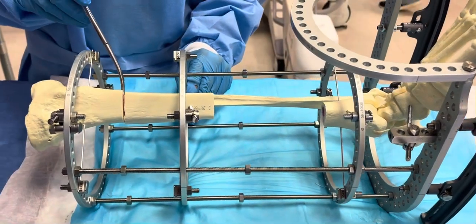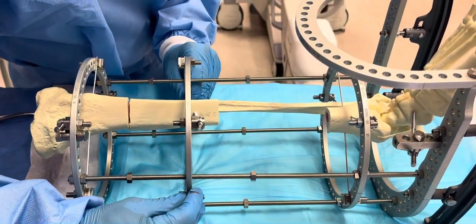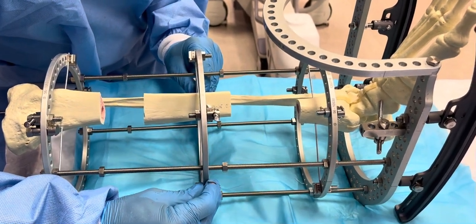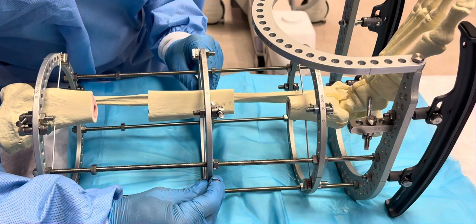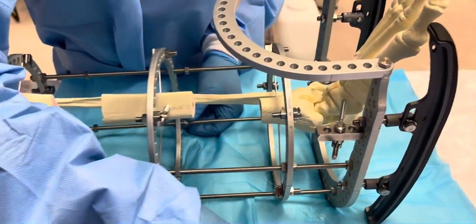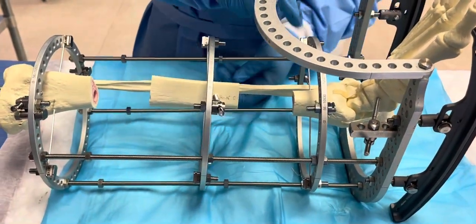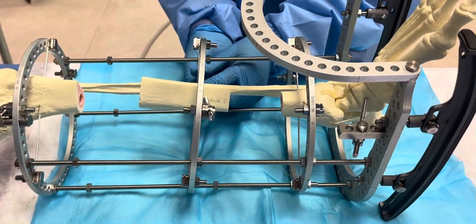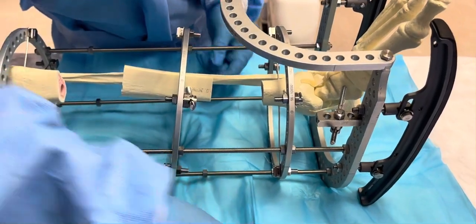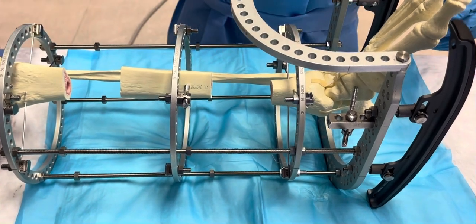An osteotomy is performed proximally at the metaphyseal-diaphyseal junction. As you can see, this segment will be displaced distally, and this is what is called a bone transport. Once this transport segment docks into the distal area, the distraction of this area will have occurred completely. It's a very simple frame.